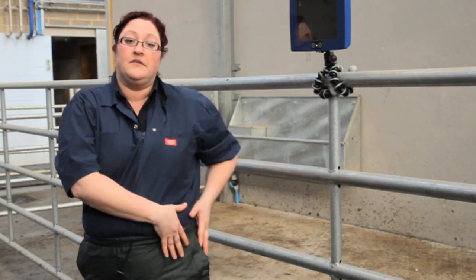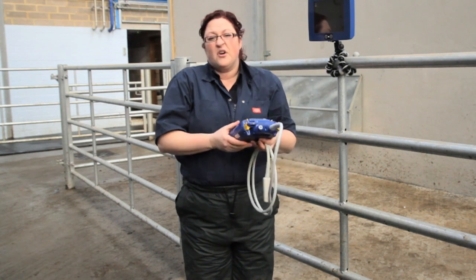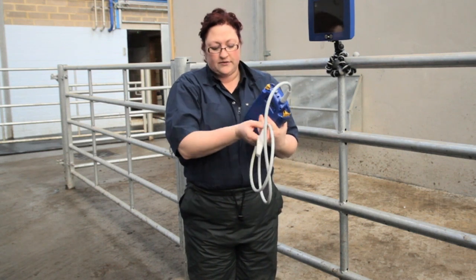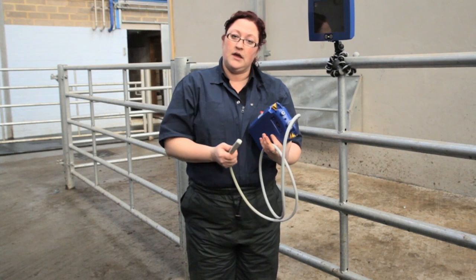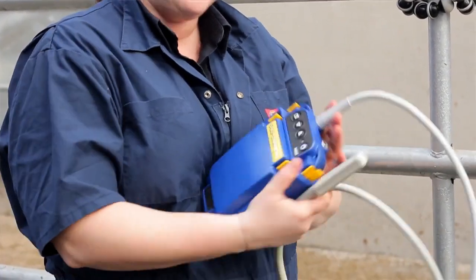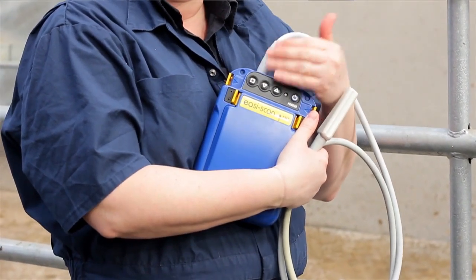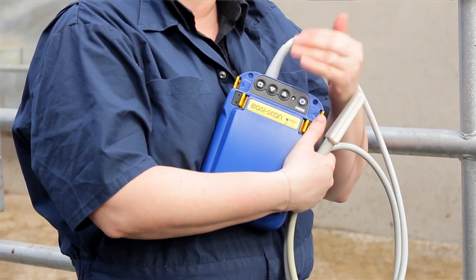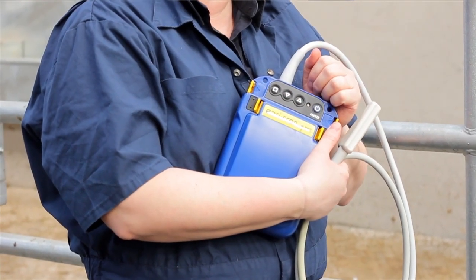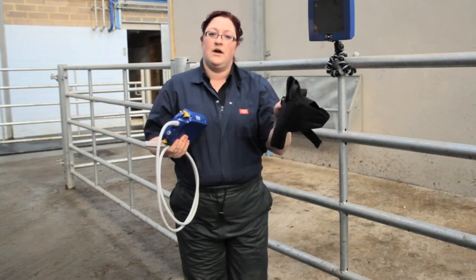Now in this particular instance with the machine that we're using, we can put it on as it sits on our hip. So we want to ensure that this stays as dry as possible. Obviously, the probe will be going inside the cow, but we need to protect the console if possible while ensuring that we keep the buttons, which will control our frequency, our depth, and our gain, accessible to us throughout the scanning period. We have a carry case.